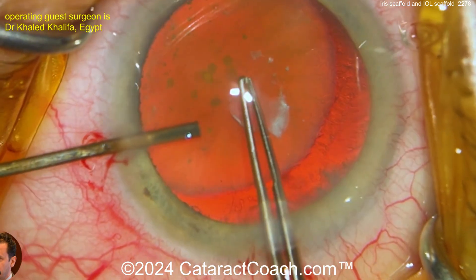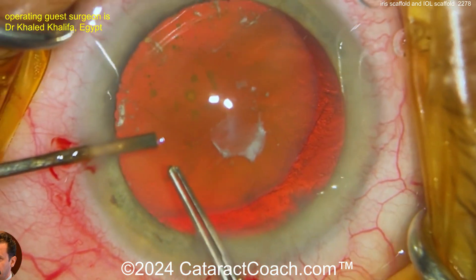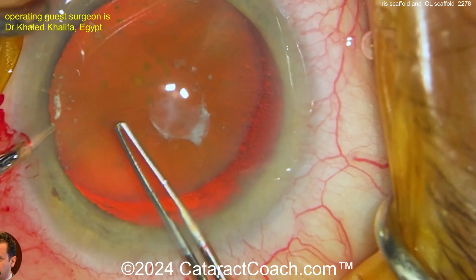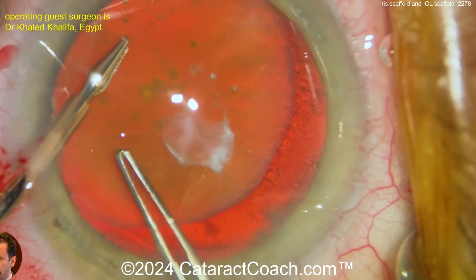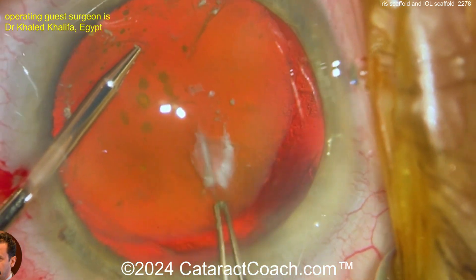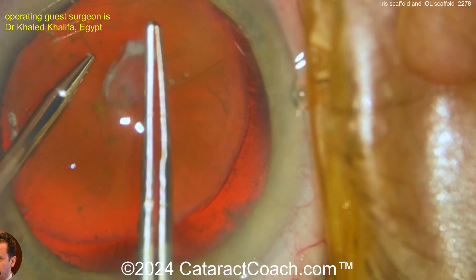Remember, as you do this, get that rhexis if you can centered up on the lens nucleus — not obviously centered up in the pupil because the lens is so displaced. You've got to use this two-hand technique, which is brilliant here: holding the capsule edge with one forcep and tearing the rhexis with the other.